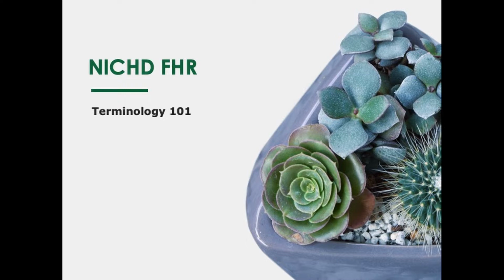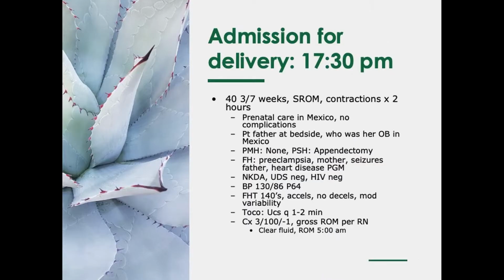When I get called and I get told I have a funky tracing, or I have bad or good, it really tells me absolutely nothing about the condition of either mother or baby. When we stick to our definitions, that's when we start to improve communication and prevent error and prevent harm. So I would encourage you after this session, and always, whenever you communicate, to use the terminology set forth by the NICHD.